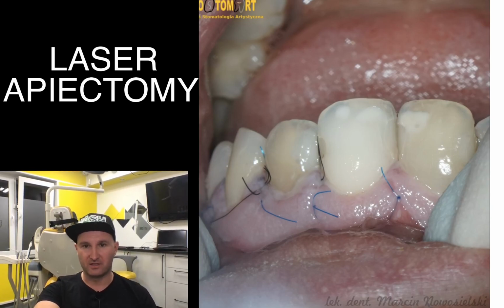The other reason is because with the erbium YAG laser we did not cause drying of the tissues during all the protocol, and we could do it very fast and in very gentle way. So all this combined together caused this effect, why patient did not need to use any painkillers.